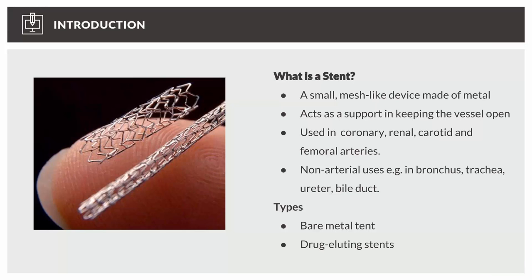And yes, there are some risks which come with a stent. First of all, if you implant a stent inside the vessel, you will have an increased risk of thrombosis due to increased rough contact surface. Just imagine, the biggest problem we have with blood is that as soon as blood is in contact with non-organic material, like for example a non-organic device like a stent, it will immediately start to get damaged. And so this is a risk which comes with stents. And another big risk is the so-called restenosis.